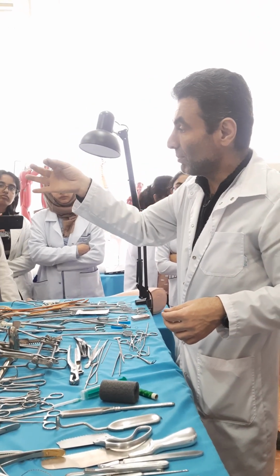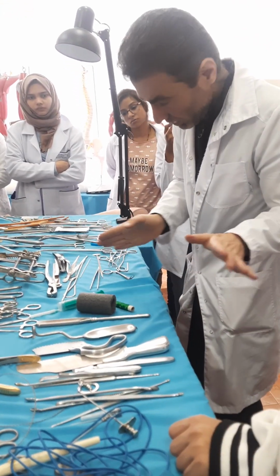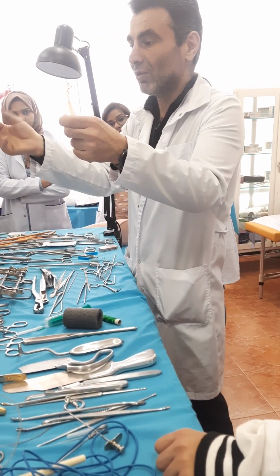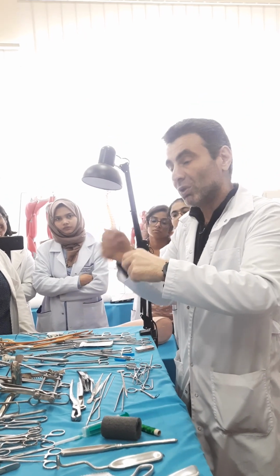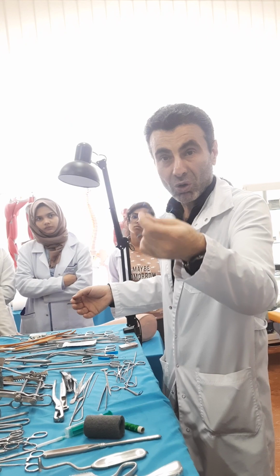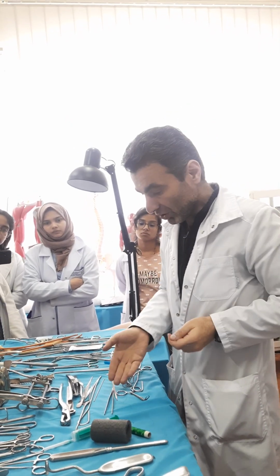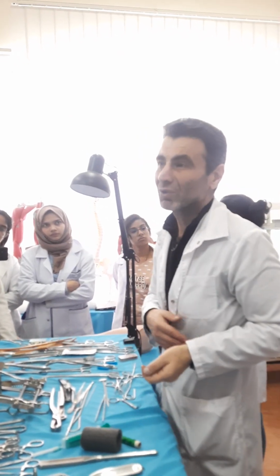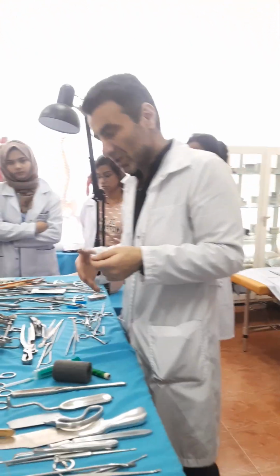But at the same time, it is good. I like to work with it. Why? Because it doesn't have memory. What does it mean? I put it in a straight position, it holds its position. Try to give the straight position to this one. Look, whoops. Memory. Thread memory. When you make the knot, it simultaneously opens. That's why you apply more knots, up to 6 for this one, to make the fixation. For that one, 3 is enough. So don't say what is better, what is not. Each one has special indications and applications.